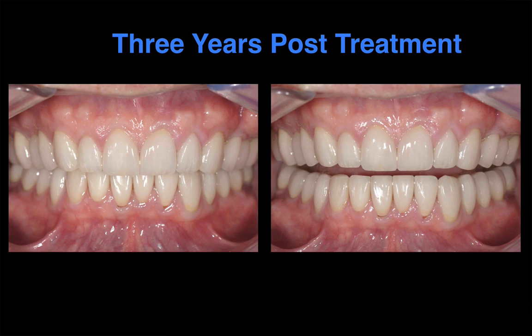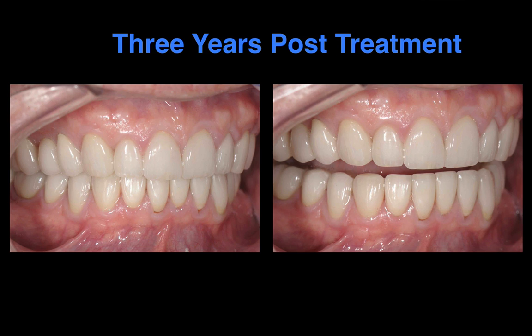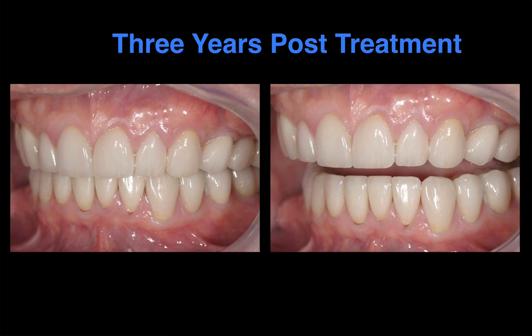And these photos were taken a while ago. They're the 3-year post-ops. You can see the case has held up exceptionally well, but we did a very nice occlusal design, very precise and thought out occlusion design for this particular case. Thought out in a precise way that I talk about every time we discuss my occlusion design course. You know, just the different things that we look at with overjet, overbite, angle of guidance, pathway of guidance, as well as degree and width of guidance.